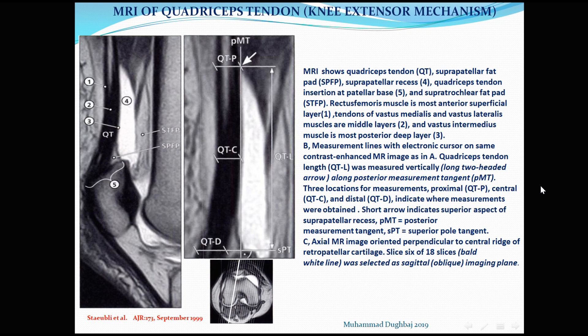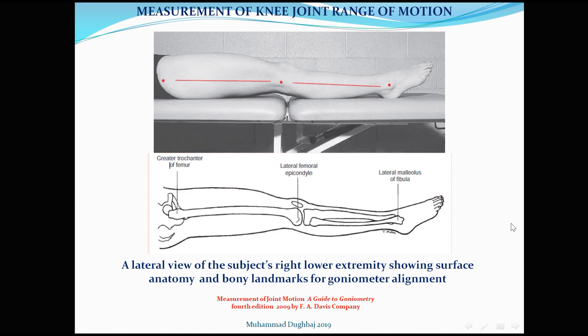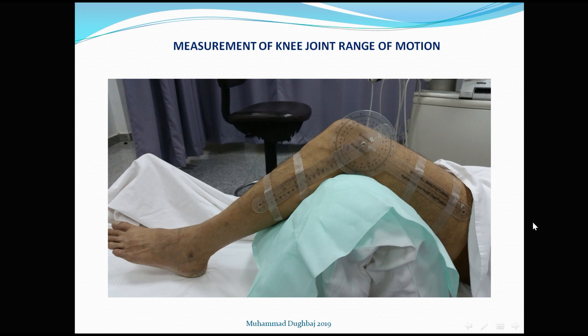Here we can see the suprapatellar fat pad — the small triangle — and the three components of the quadriceps tendon. This is how we perform standard goniometric measurements of extension and then flexion, and how we apply the goniometer during examination. We use a dynamic study of the quadriceps tendon to calculate the painful range of motion during both extension and flexion.